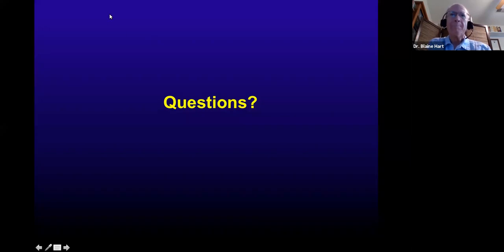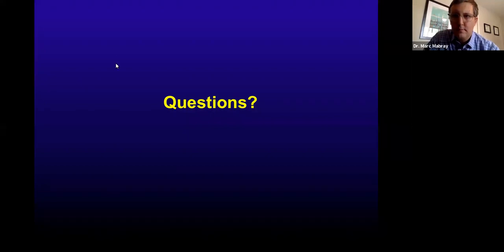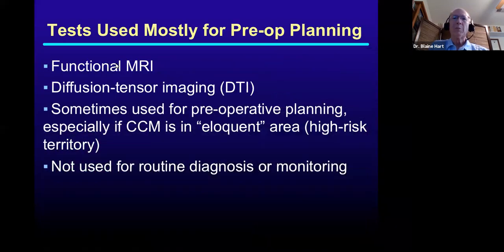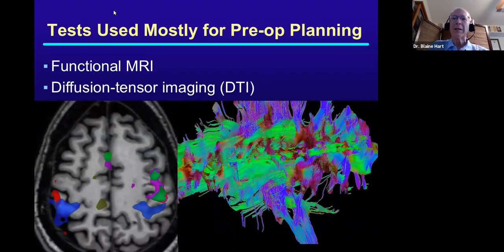I mentioned that mapping is frequently used now using a detailed MRI beforehand, and then the surgeons can use that during the surgery to help guide them. So they can actually move a needle and see in space where that is relative to the MRI. So the advantage of the intraoperative MRI is they can actually look at changes as they go along. Tends to be used more for probably tumors than cavernous malformations, but they can get operative guidance with the MRI now. Yeah, that's a great point.